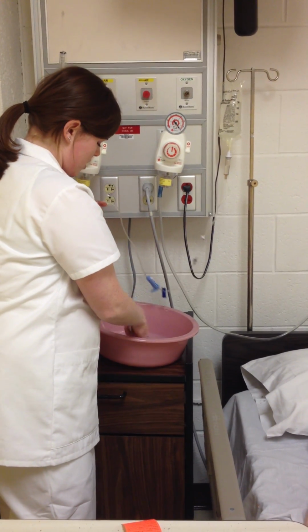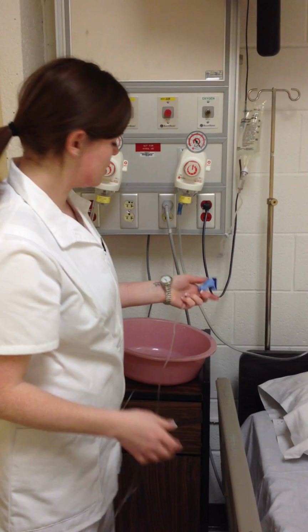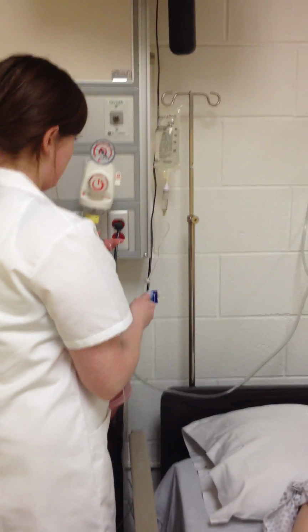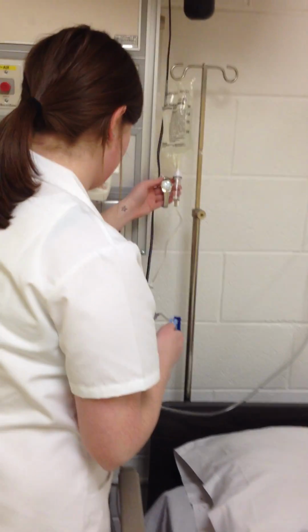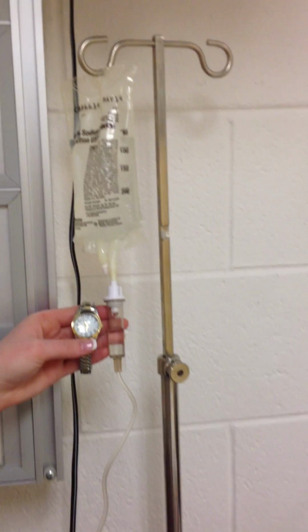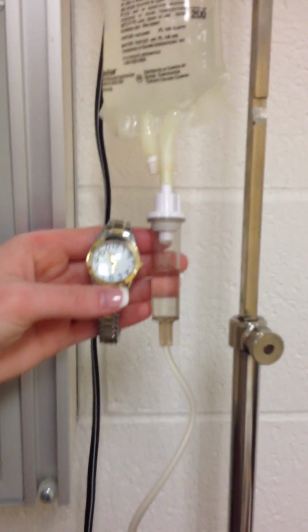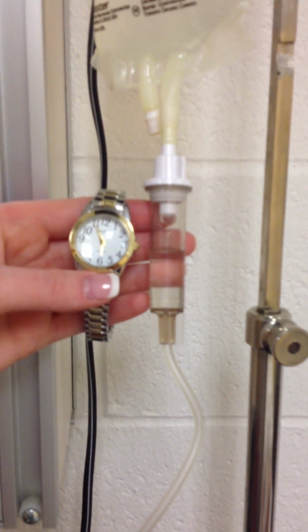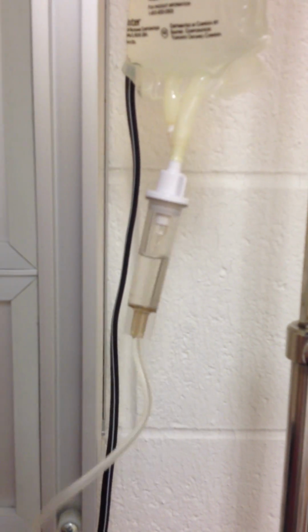And then I'm going to calculate the drip rate, and I'm going to do 60 drops per minute, which is going to be 15 drops per 15 seconds. Okay, that's 15 drops in 15 seconds.